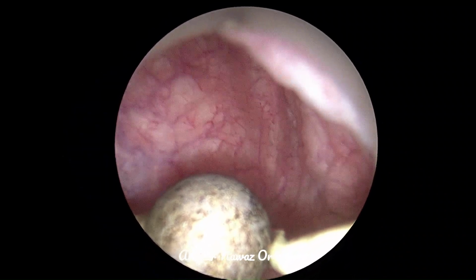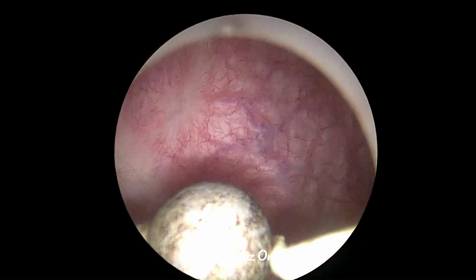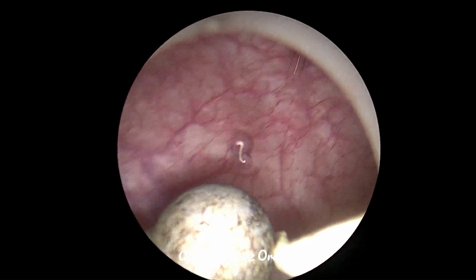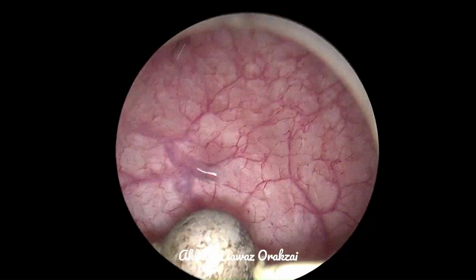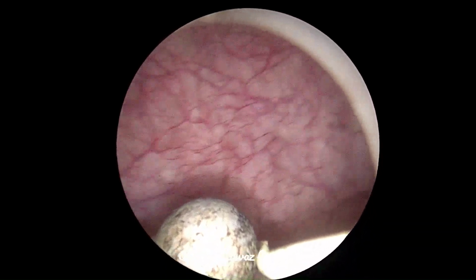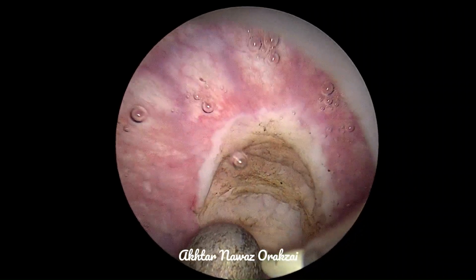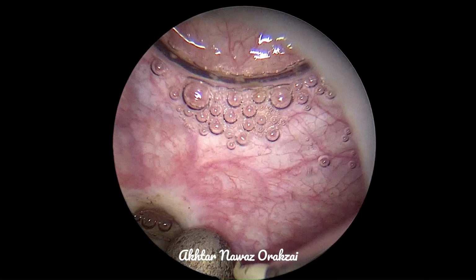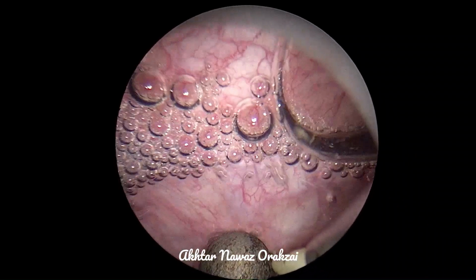And second is that this may lead to injury of mucosa and lead to bleeding, and bleeding again will hamper the vision, and hence one will not be able to see small growths. Recurrences are usually small papillary projections, and they need to be seen with the eye of an eagle.